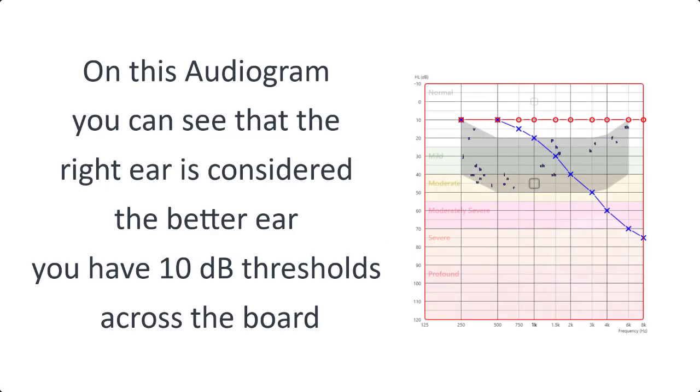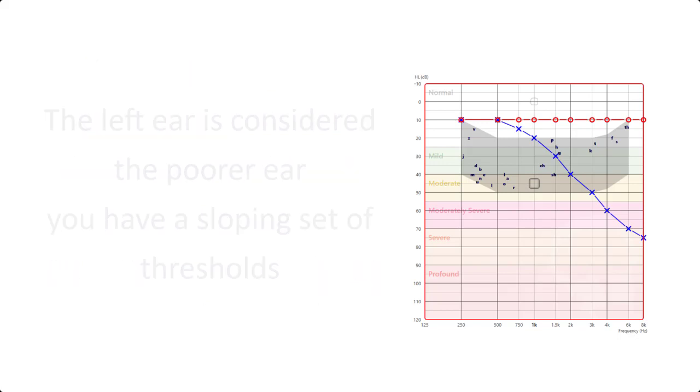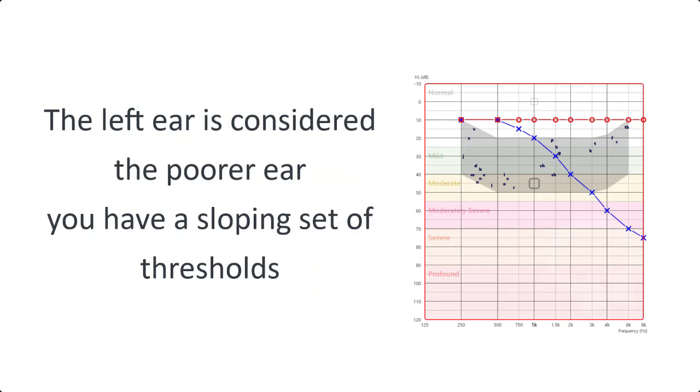On this audiogram here you can see that the right ear is considered the better ear and you have 10 decibel thresholds across the board. The left ear is considered the poorer ear and you have a sloping set of thresholds.